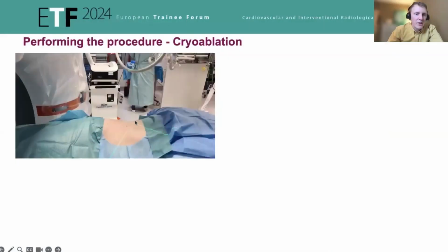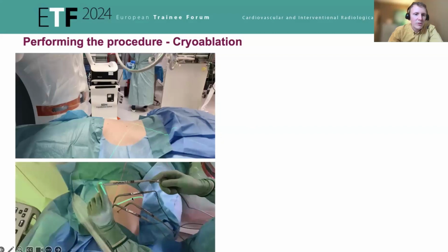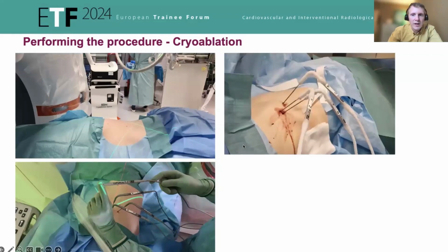And after planning, we activate this laser, which tells us where the entry point in the skin is, but you can use other systems as well to know where to start with the needle. And then we put in the needles by the planning.